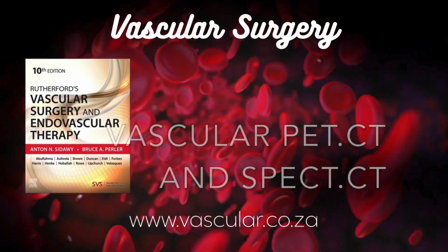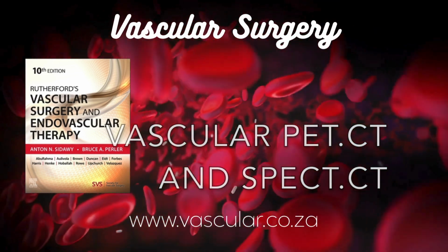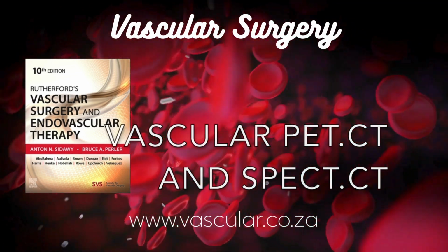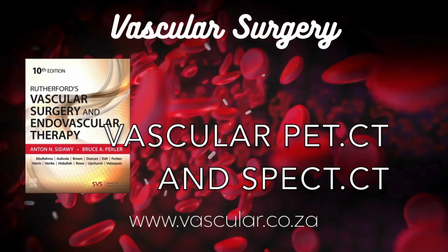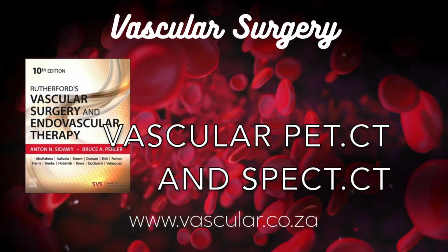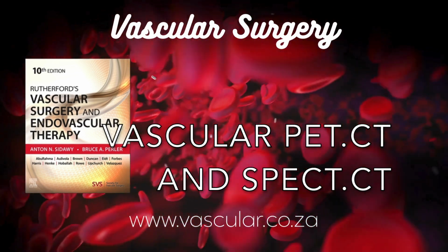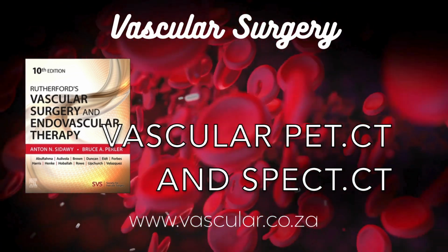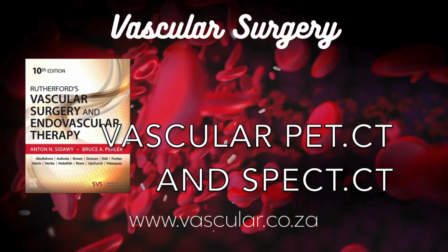Not at all. It probably reflects different stages of the atherosclerotic process. A heavily calcified plaque seen on CT might represent older, more burnt-out disease, perhaps less actively inflamed. Scar tissue, almost. In a way. Whereas FDG uptake, even if there's also calcification, likely points to ongoing active inflammation, maybe related to those microcalcifications NaF picks up, potentially indicating a more unstable situation.